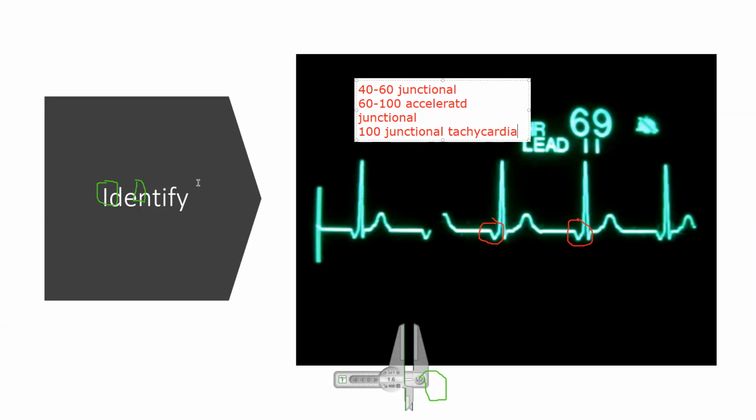So what's the implication of an accelerated junctional rhythm? Well, any beats that come from the AV node are usually manifestations of an abnormality in the AV node. But a lot of times it's a reflection of drug effects, in particular digitalis. Not actually toxicity, or not necessarily toxicity, but only a drug effect. Okay, so any drug that exerts an effect on the AV node may cause junctional rhythms.